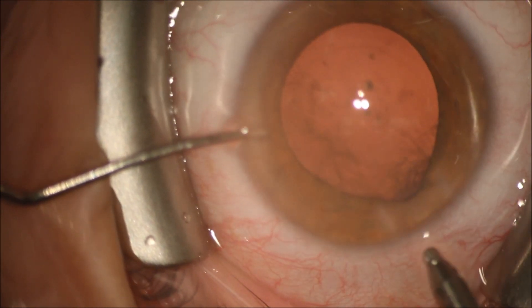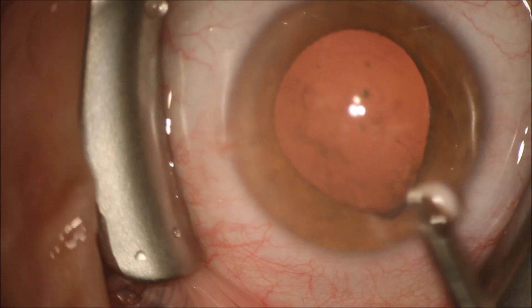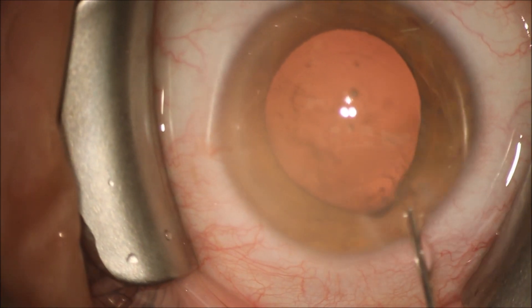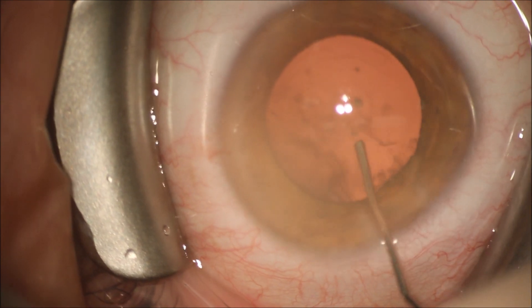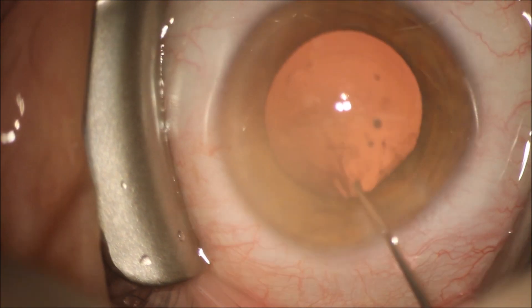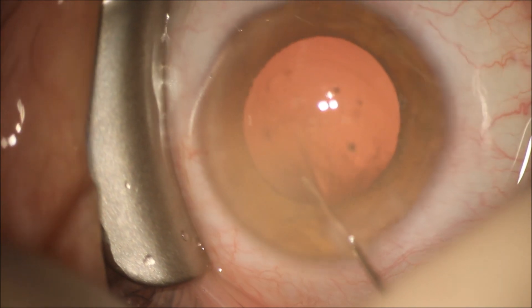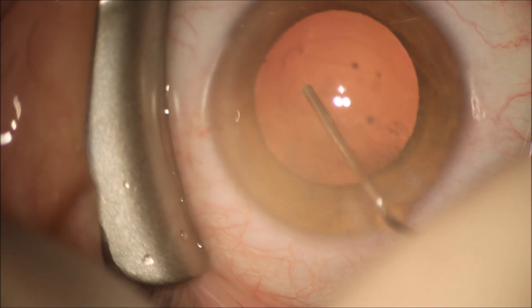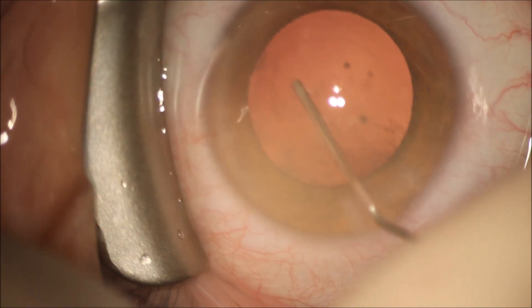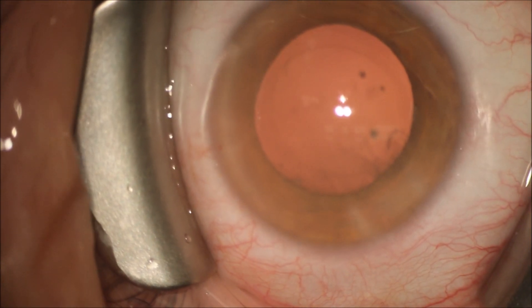We're removing the subincisional cortex with the automated irrigation aspiration handpiece, and once we've completed this, we will use the balanced salt solution on a 27-gauge cannula to power wash off these resistant pieces of posterior subcapsular cataract and cortical material. This is a very fast, easy way to remove this with little risk of rupture of the posterior capsule. Having used this technique in the last 2,000 cases, I've never ruptured a capsule with a 27-gauge blunt cannula.